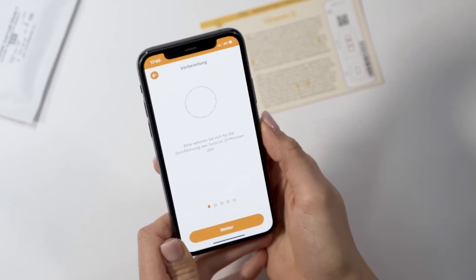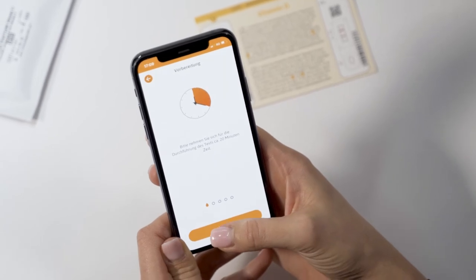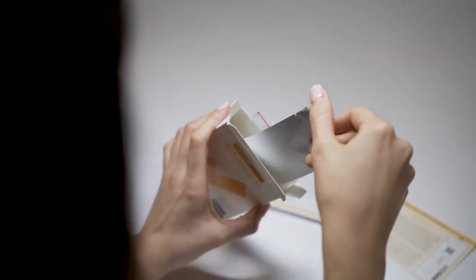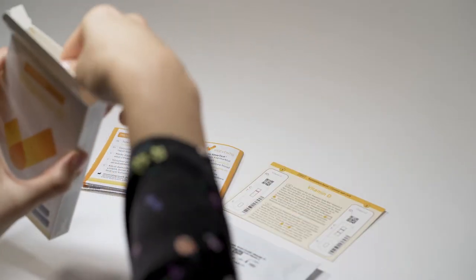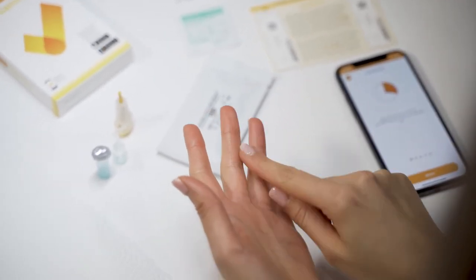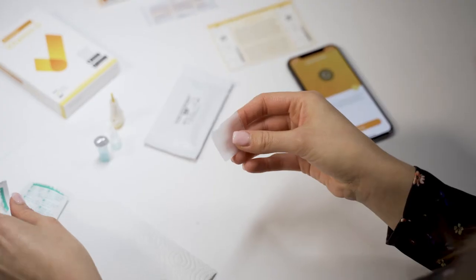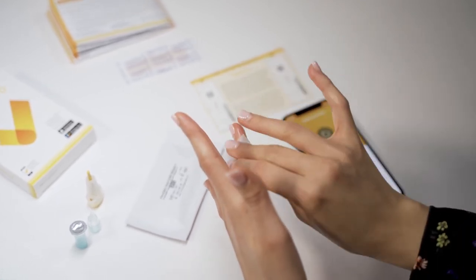We will support you with a video tutorial on how to perform the test. This should take approximately 20 minutes of your time. Prepare the test components and leave the test cassette still in its packaging. Make sure not to touch the tip of the capillary. The lateral areas of the fingertip of the middle or ring finger are particularly suitable for blood collection. Rub the selected finger until it is warm and well supplied with blood.